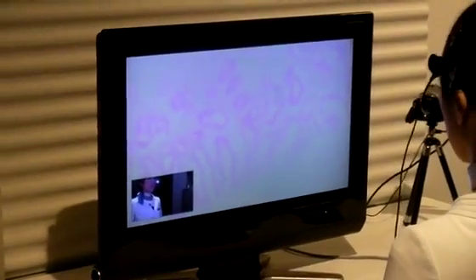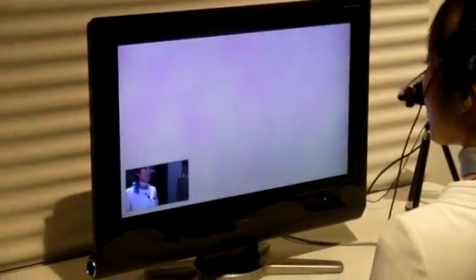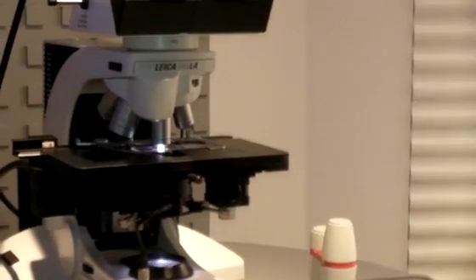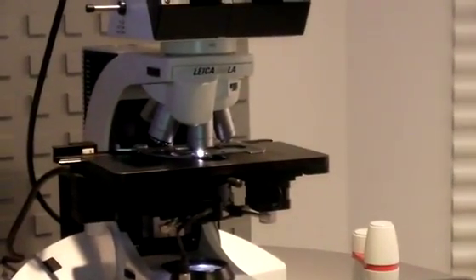Now with this controller we can control the microscope over there. You can see that it's actually moving. With the low latency transmission made possible by the NGN and the low latency codec we can smoothly control the microscope from outside.